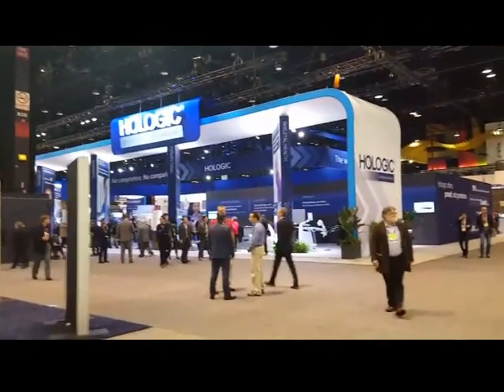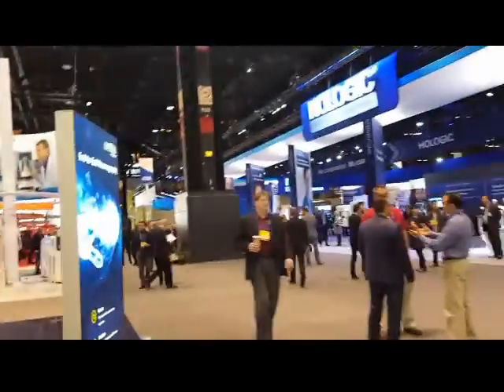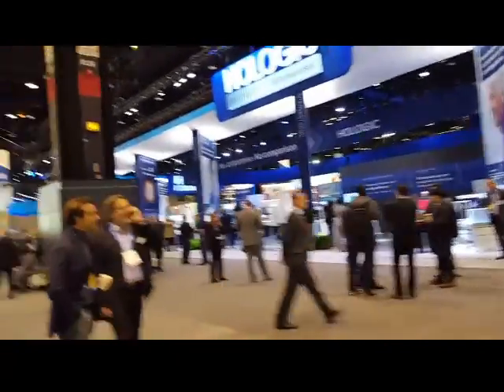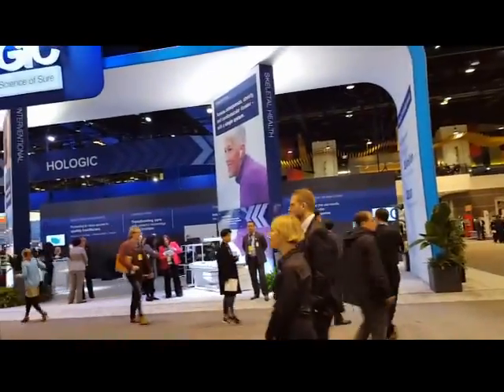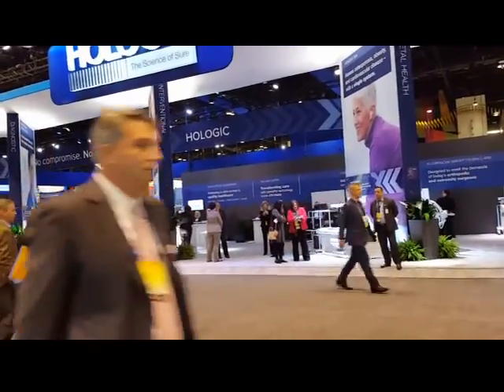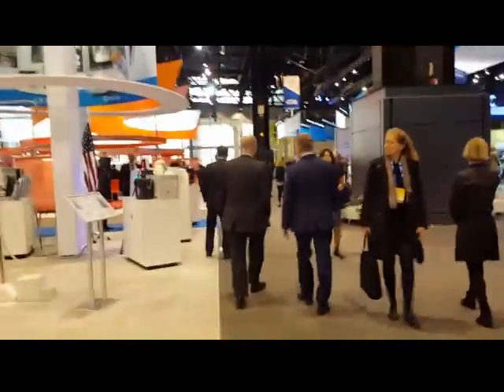Here's the Hologic booth, which is pretty darn big. They're making a lot of money. Talking to people out here, they're clearly the leader in mammography. A lot of people say it's because they dedicate most of their healthcare systems to women's health, so they do get props for that. I'm supposed to meet with Lisa and Dr. Ellison here, and the reps are going to show us some newer equipment, which I will videotape for everybody.